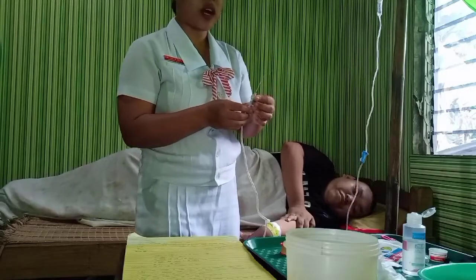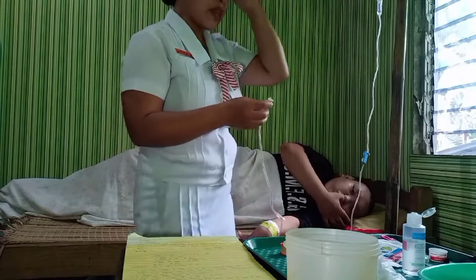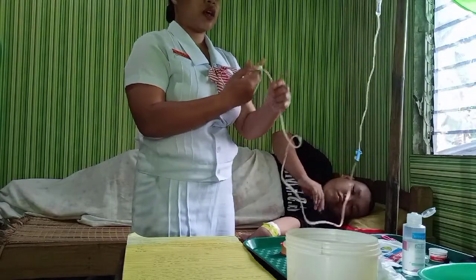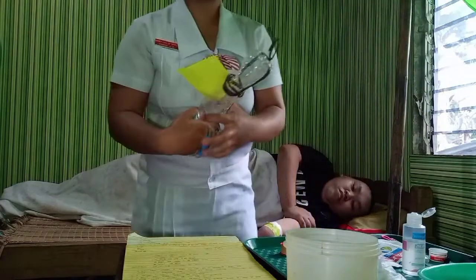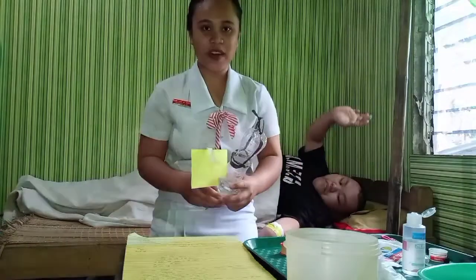We need also to discard the cannula first into the sharp container, and then we need to roll the tubings like this. And this will be put into the disposable container. That would be all. Thank you.